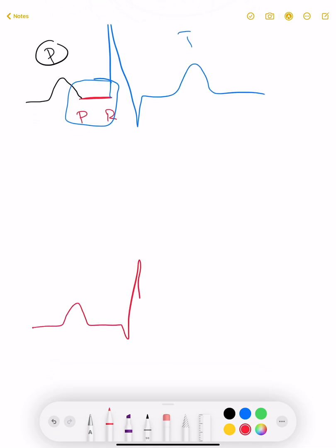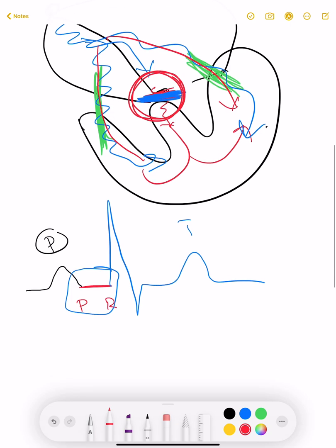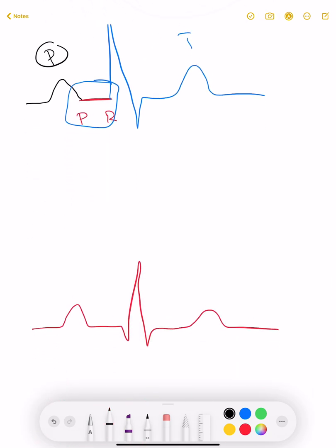Our normal ECG was expected to look a certain way. But in pre-excitation syndrome, when accessory pathways allow the impulse to reach the ventricle earlier, the expected ventricular depolarization happens ahead of schedule — causing an early upslurring in the PR interval segment. This early upslurring or up-slope is called the delta wave.